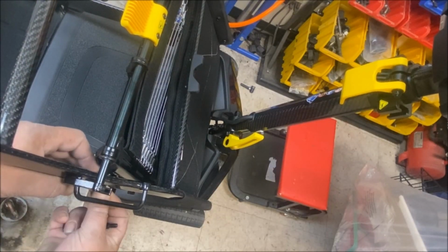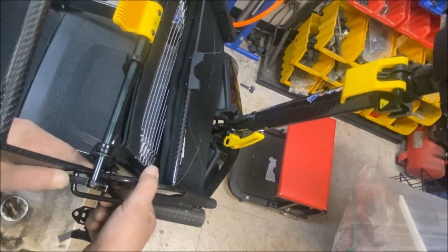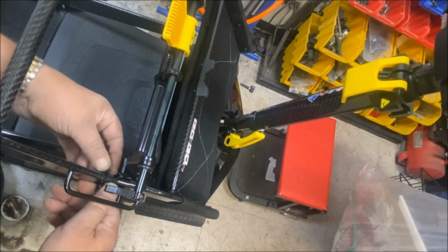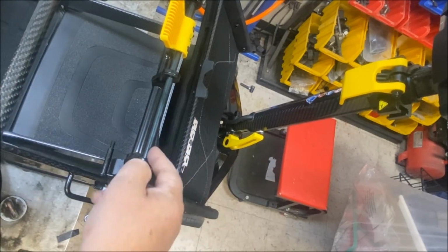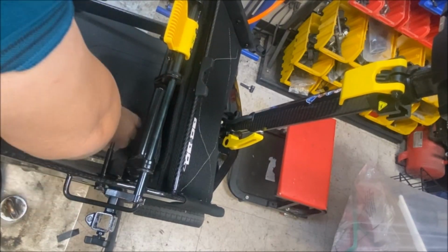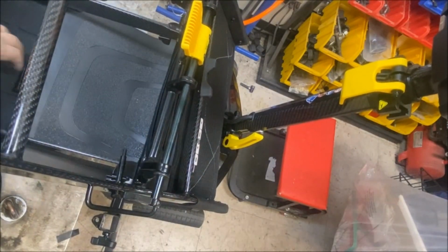So, first insert. That's already on there. There's one already on the bump. Not the easiest job, I'll tell you that. Okay. And the second insert. I would suggest making sure these two inserts are in place on the seat frame portion first before you do anything else. Reinsert those. If you need to grease them again, you can. So I've got both inserts on there, and they're on the seat frame piece, not on this piece because that's on there.